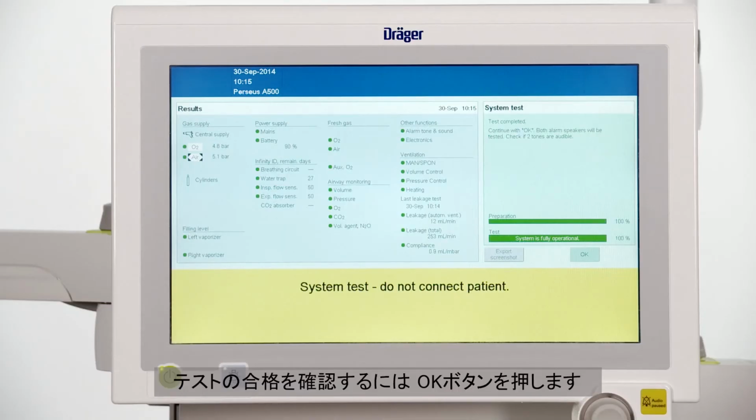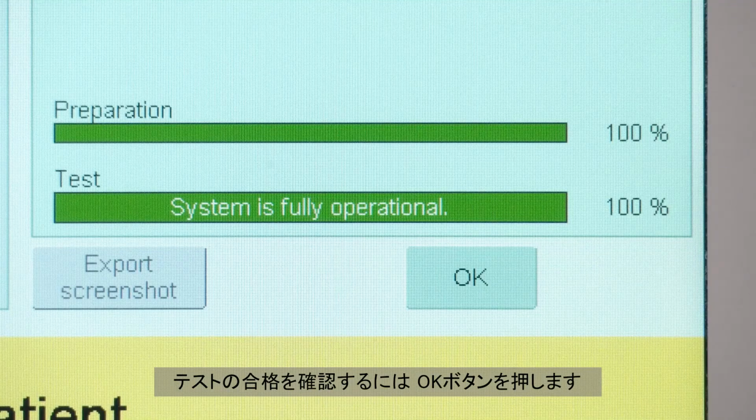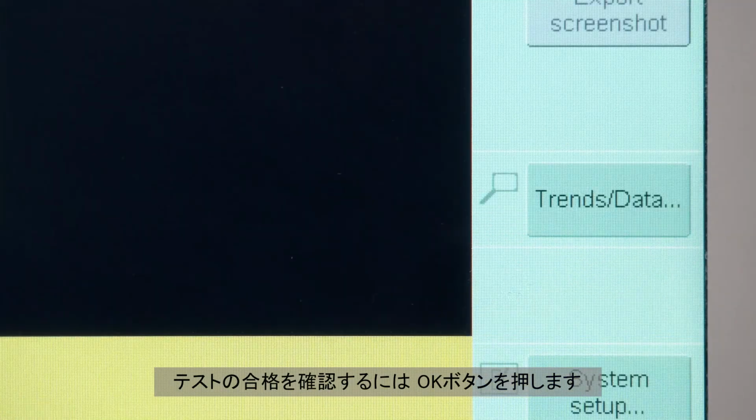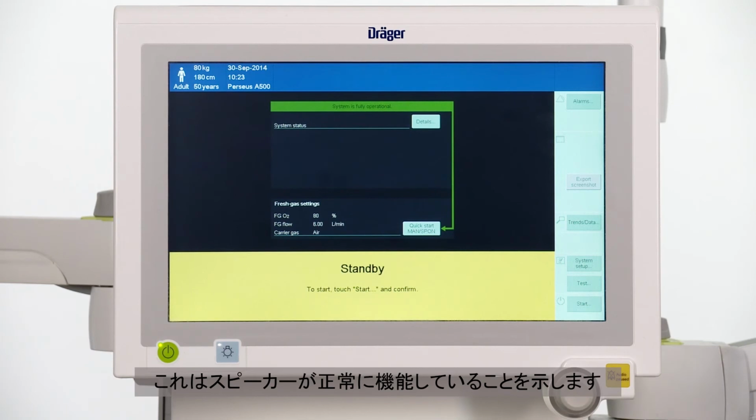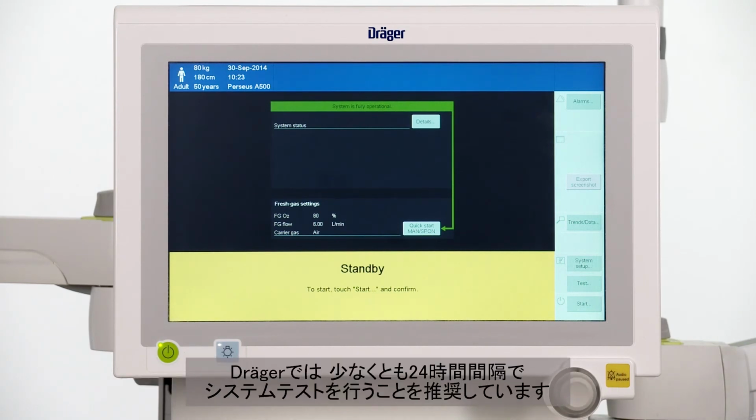To confirm a passed test, press the OK button. Pay attention to two tones emitted by the speaker which indicate the correct functioning of the speaker. Dräger recommends that the system test is completed at least every 24 hours.